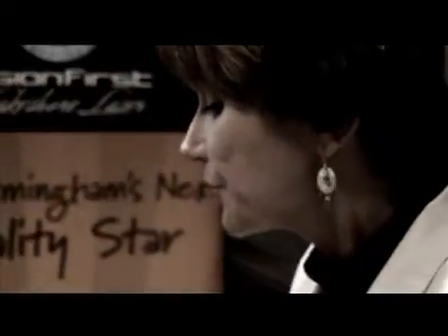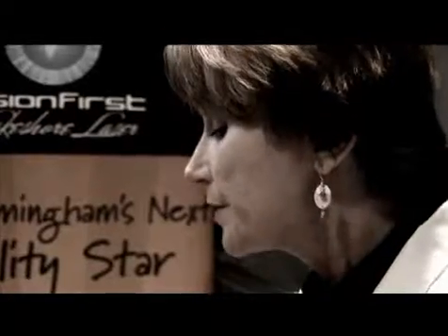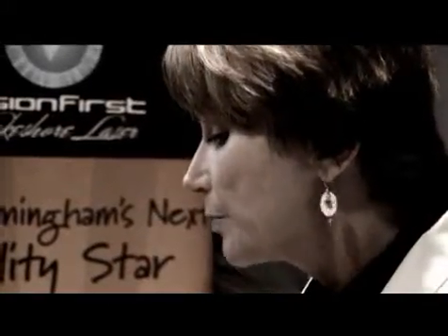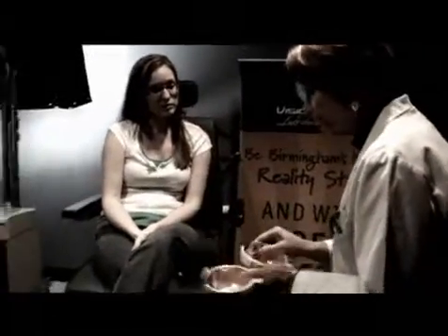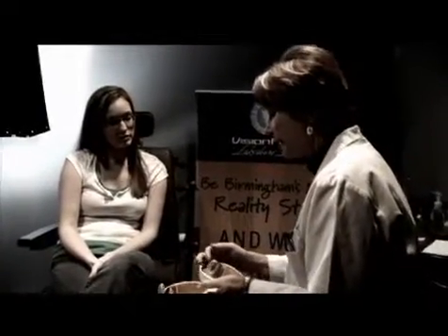The laser vision correction flattens the curvature of the cornea, and we could flatten your cornea for your degree of nearsightedness. The problem is that your cornea would be very flat, and at night when your pupil dilates, the light will be coming in on the larger part of your cornea, which is really flat, and you can have some poor night vision. So the better recommendation for you would be to do what's called the Visian ICL. Instead of operating on your cornea, we go in with a little incision and implant a lens implant on top of your natural lens beneath your iris. I'd say we have an extremely high chance that with just the implant of the Visian ICL, without laser vision correction, you could be 20/20 or 20/15. Okay.